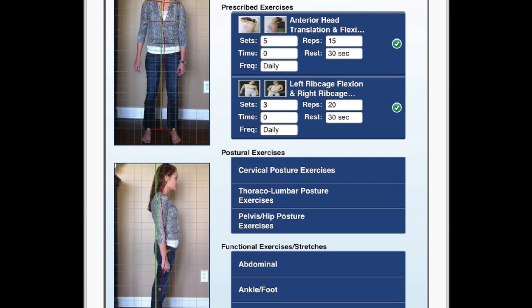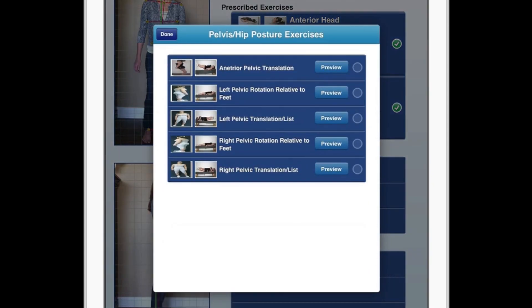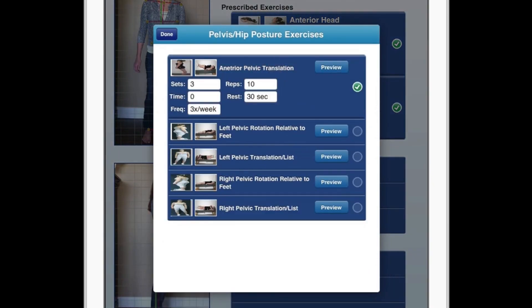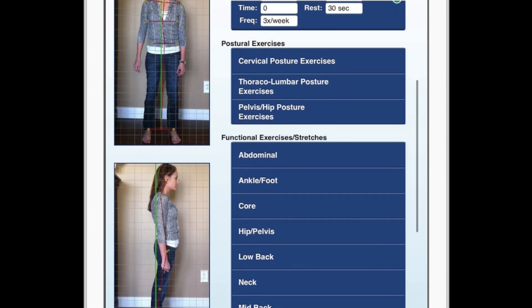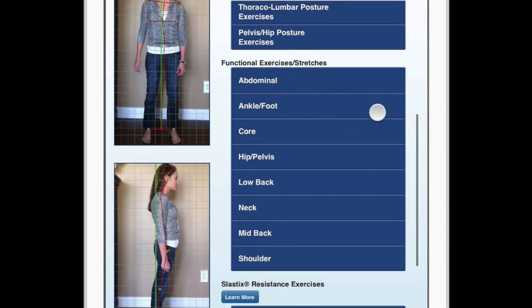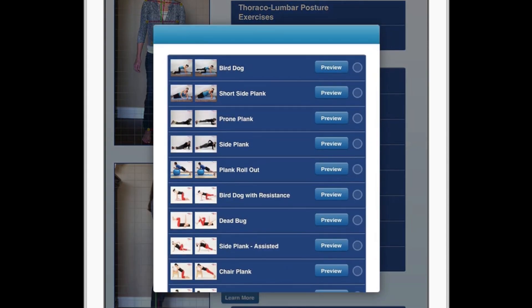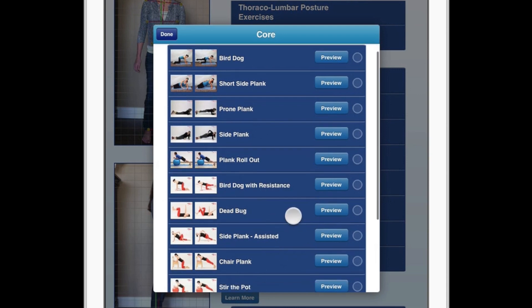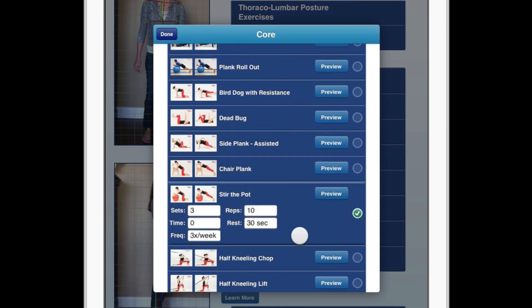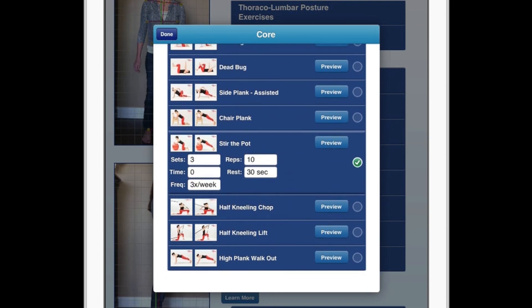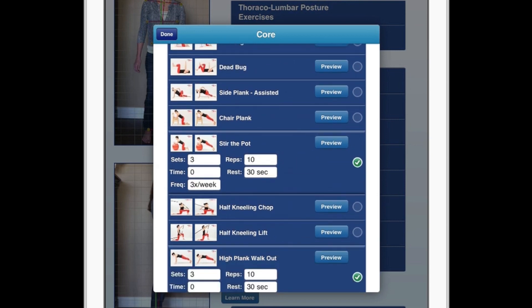With that being said, I can see that her pelvis is anteriorly translated relative to her feet, so let's go ahead and prescribe that exercise. I would also like to prescribe some functional exercises — a core exercise, as well as this exercise.